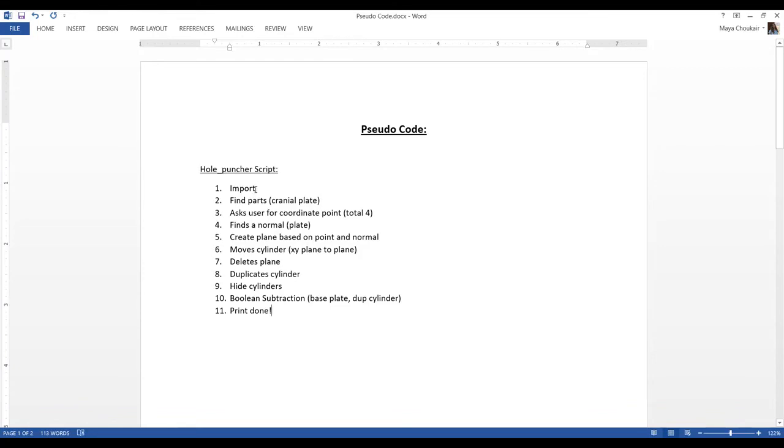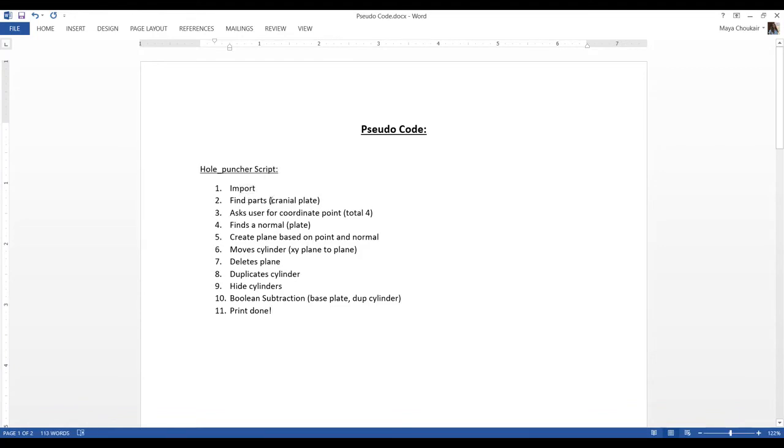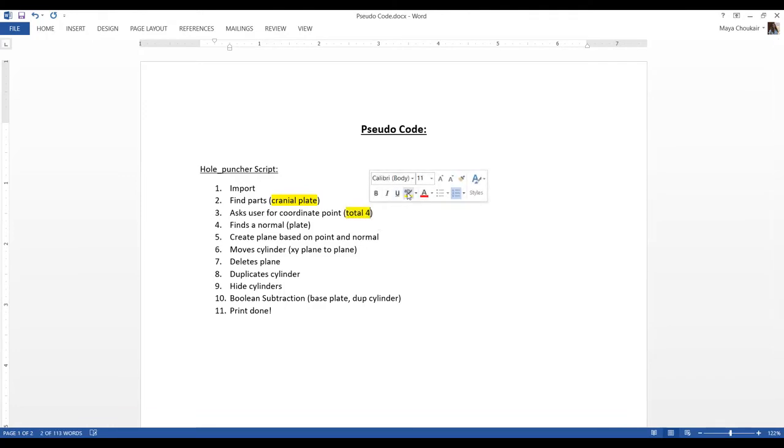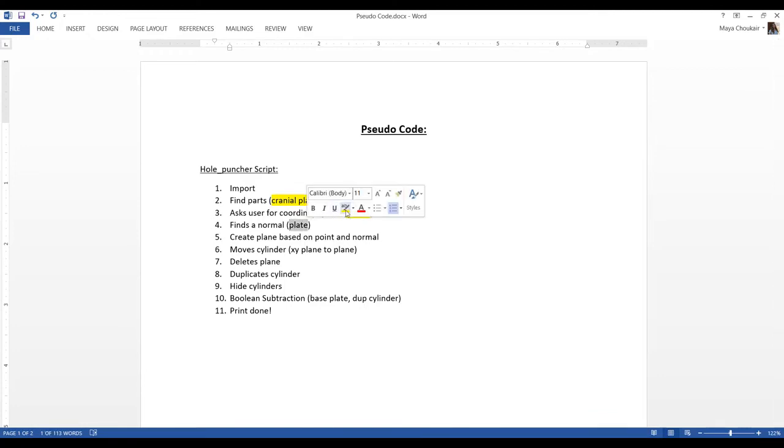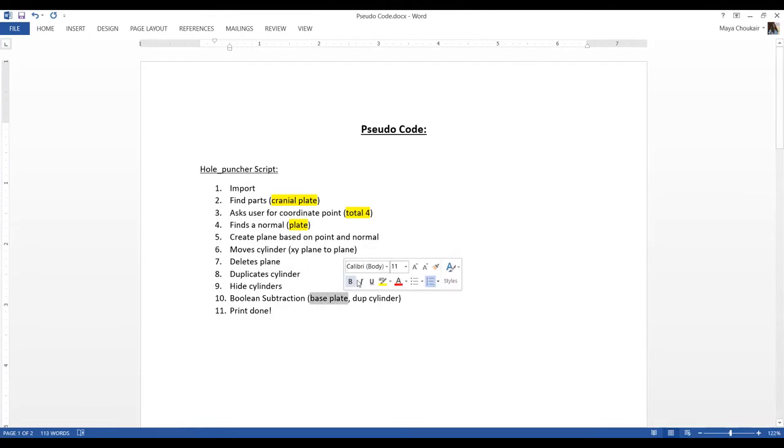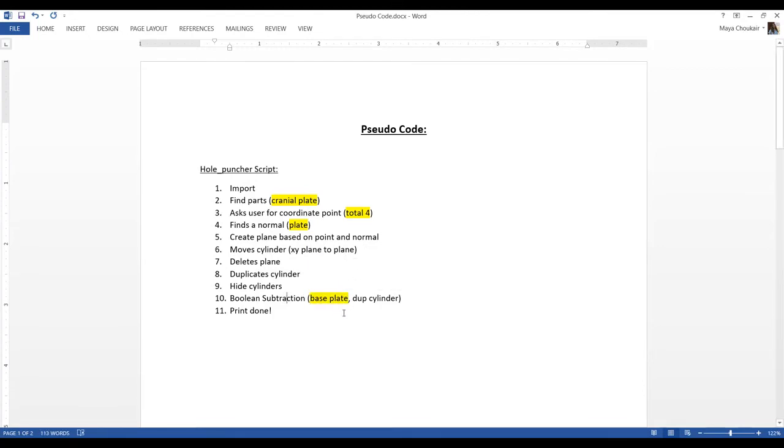Well, the first step, import, that's good. Finds the parts. I want it to find my mitral model. So we're going to need to make sure to change that step. For the number of points, I typically will need more than four points for my suturing. So let's say maybe six points here. Fits the normal to the plate, but we want it to our mitral model. And then everything else is good up until the boolean subtraction, where we need to subtract the model instead of the plate.